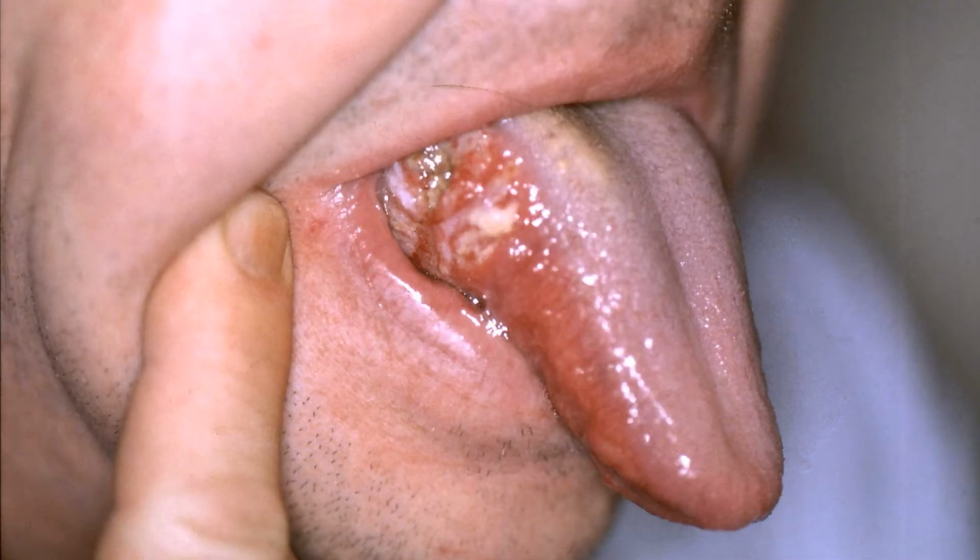Next is oral cancer or tongue CA. This is a lesion in the tongue. You can see that the lesion is protruding and has ulceration in the center. It is poorly defined, and in the center the ulcer base is very necrotic with areas of hemorrhage and necrosis.